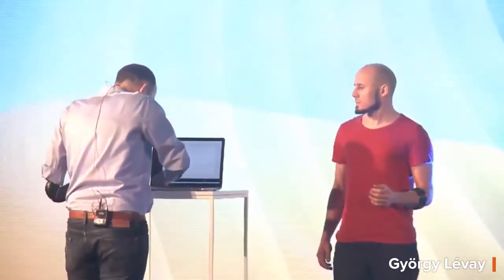So you're going to have 6 movements, which is actually 7 different classes. And those are going to be the movements that hopefully you're going to be doing on this hand as well.